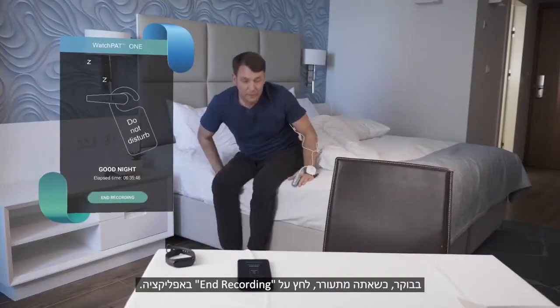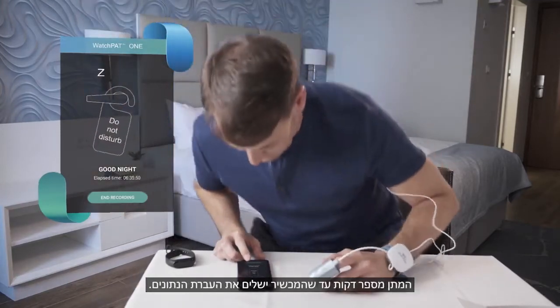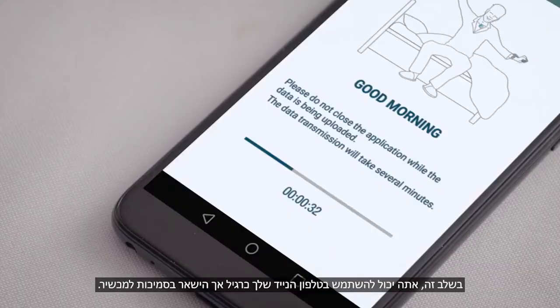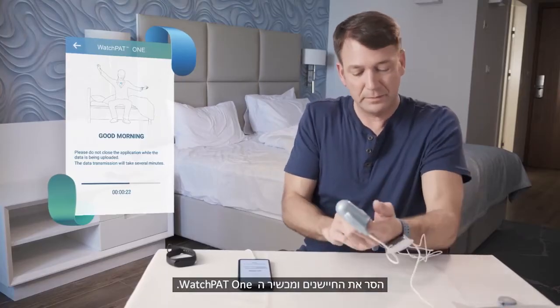In the morning when you wake up, press End Recording on the app. Wait for a few minutes until the device completes the data transmission. At this time, you may use your mobile phone as usual, but stay within the device proximity. Remove the probe, sensor, and WatchPat One device.